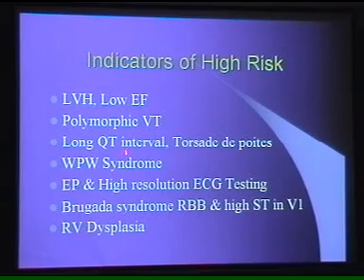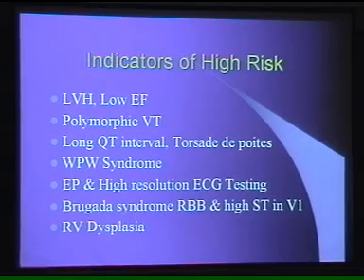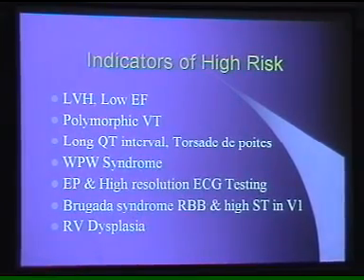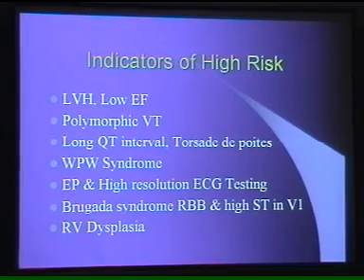These are the typical ECG changes which can predict a future high chance of sudden death. Patients having these electrical ECG abnormalities should be investigated beforehand, because their chances of getting a sudden cardiac arrest are very high.